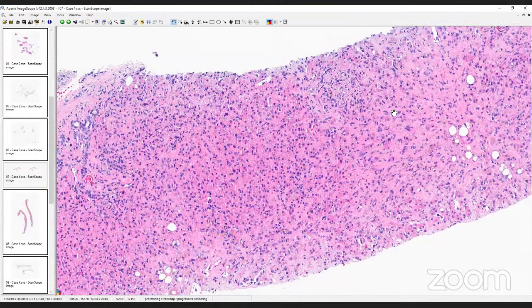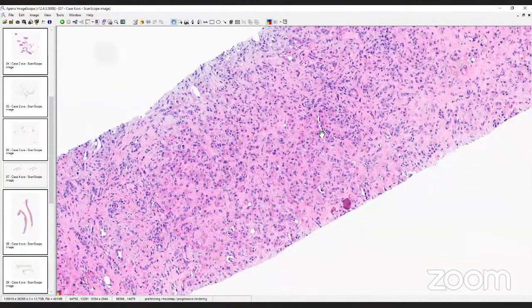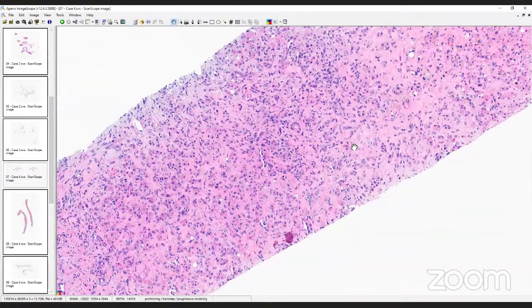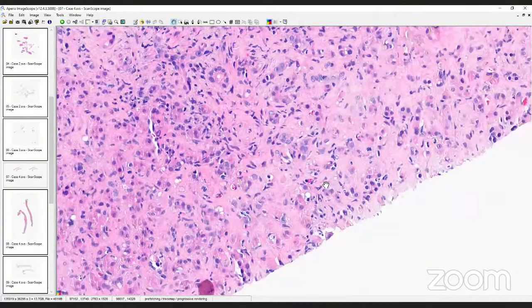And so I set out to prove that, because if you can prove that, then you're done. You made the diagnosis. I did a special stain, but before I go on to that, I want to just point out some things here. For example, here, there are two very ugly nuclei with something pink in between. There is another one here that is like a signet ring cell. So you have a hyperchromatic nucleus and a vacuole that contains a red blood cell. And then you have another one over here.